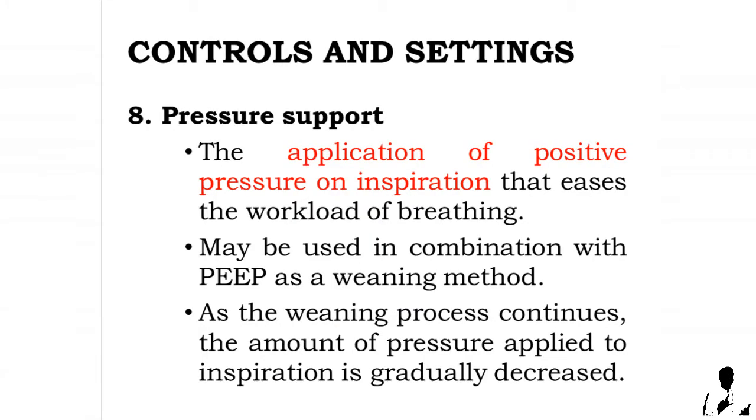8. Pressure support. The application of positive pressure on inspiration that eases the workload of breathing may be used in combination with positive end expiratory pressure as a weaning method. As the weaning process continues, the amount of pressure applied to inspiration is gradually decreased.